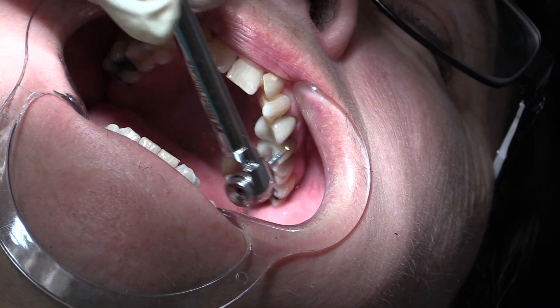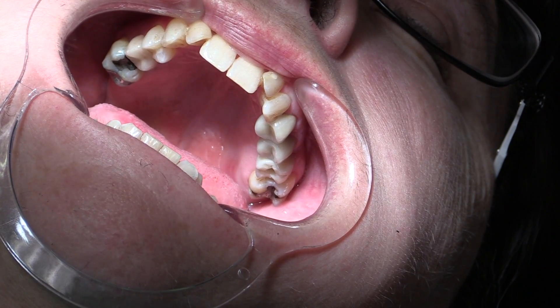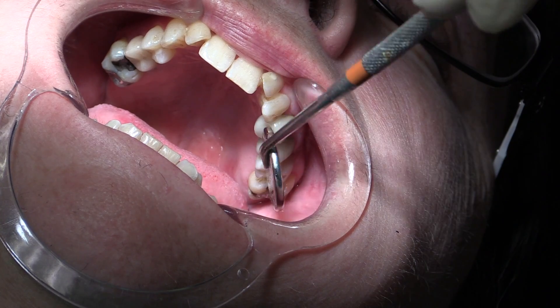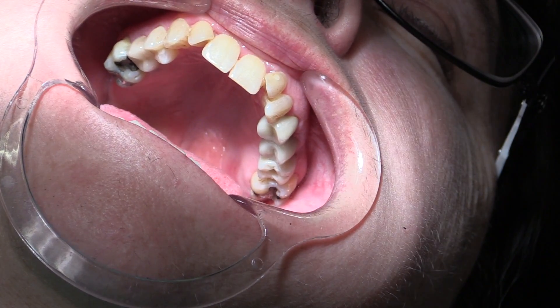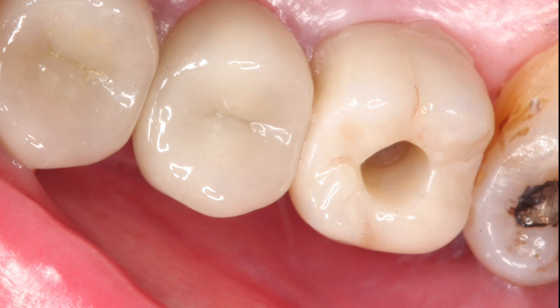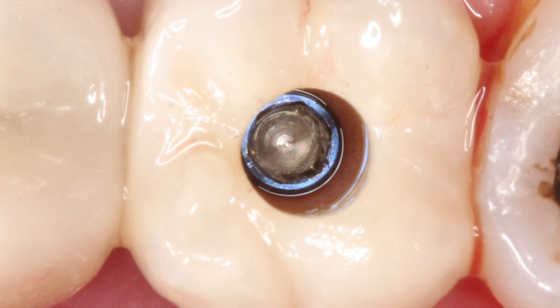You can see how it's stuck in the screw — this is because it's an OmniGrip system, which is great for working in the posterior aspect of the mouth. It allows you to be in a position where you can tighten things without worrying about dropping them. Looking at the zirconia going inside, you can see the OmniGrip screw is a blue color. You have to make sure you use the proper driver when tightening or loosening it, or you can strip it.